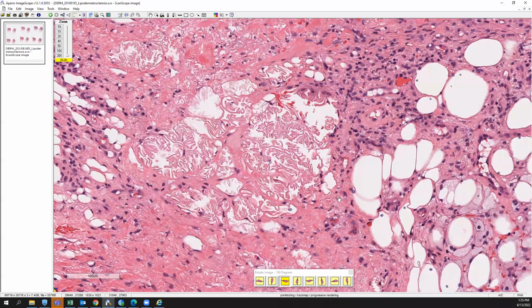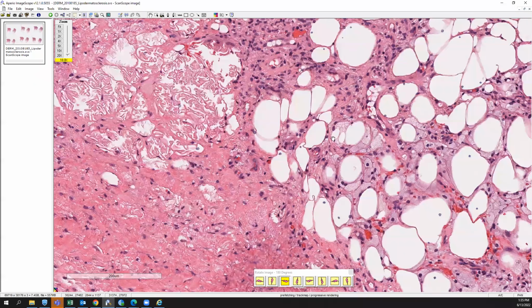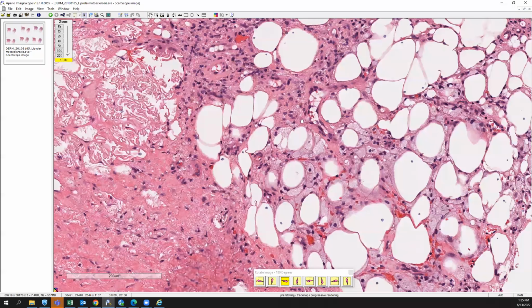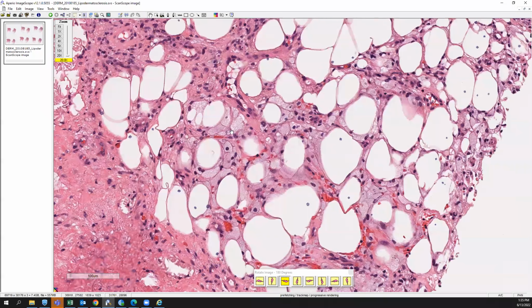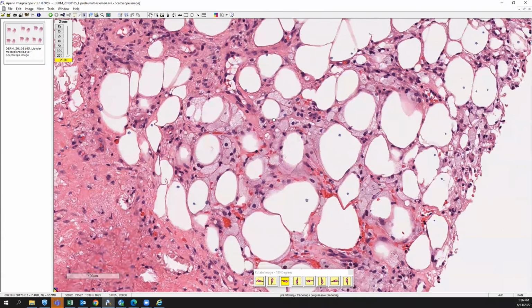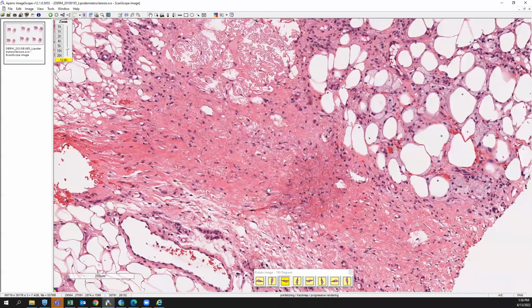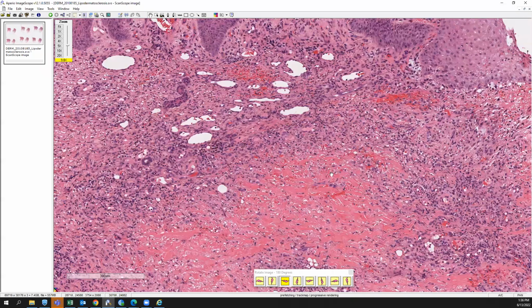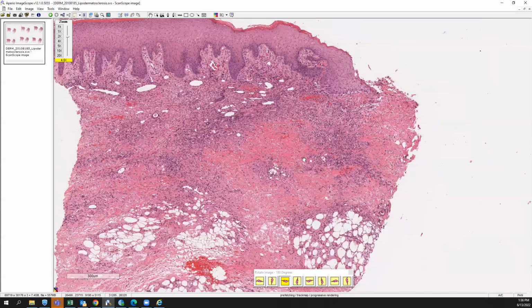You can see it in lupus profundus or lupus panniculitis as well, but when you have this mix of homogenized eosinophilic change in and amongst the adipocytes with degeneration of the fat lobules, maybe some lipidization of surrounding macrophages, or foamy histiocytes, and then this lipomembranous change with overlying superimposed venous insufficiency changes, your best answer is going to be lipodermatosclerosis. So those are the major features that you're going to want to look for on a biopsy.